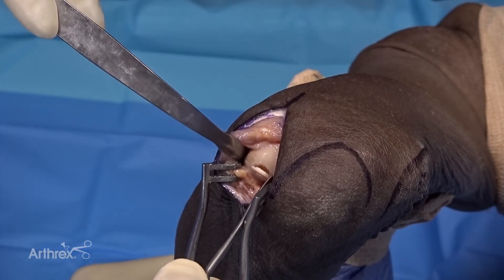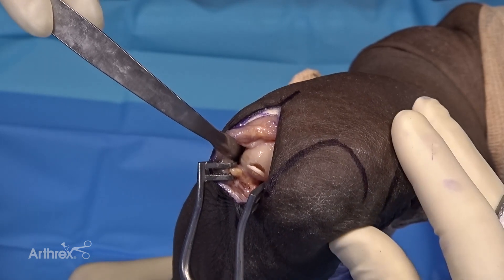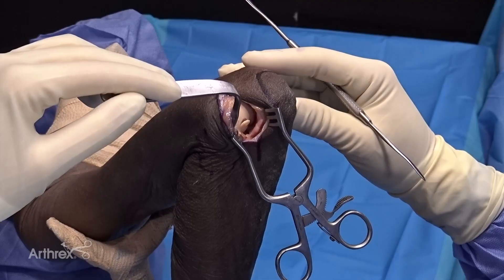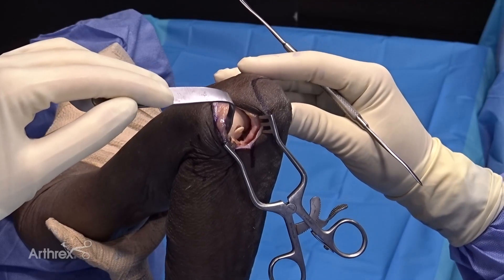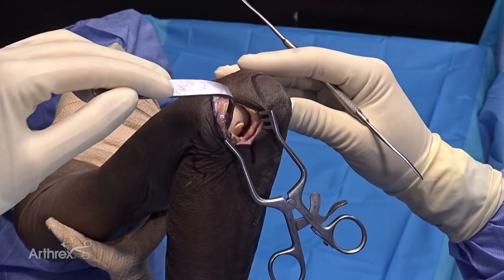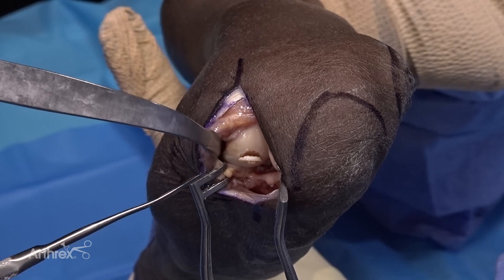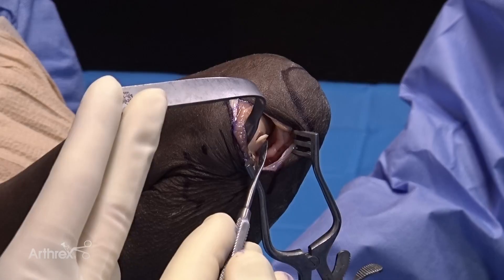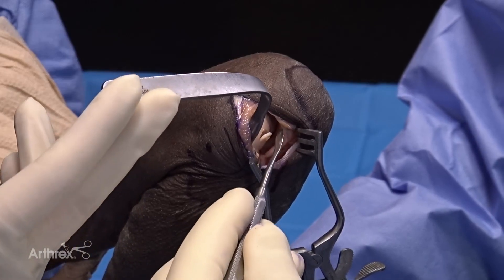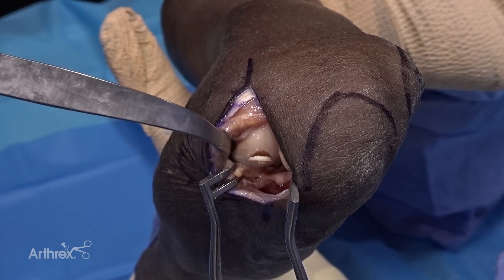To provide additional access, the elbow and forearm can be supinated to cause the ulna to slightly subluxate at the level of the olecranon, providing additional exposure. With our retractors in place and the elbow in the flexed position, we have excellent exposure of the capitellar articular surface.